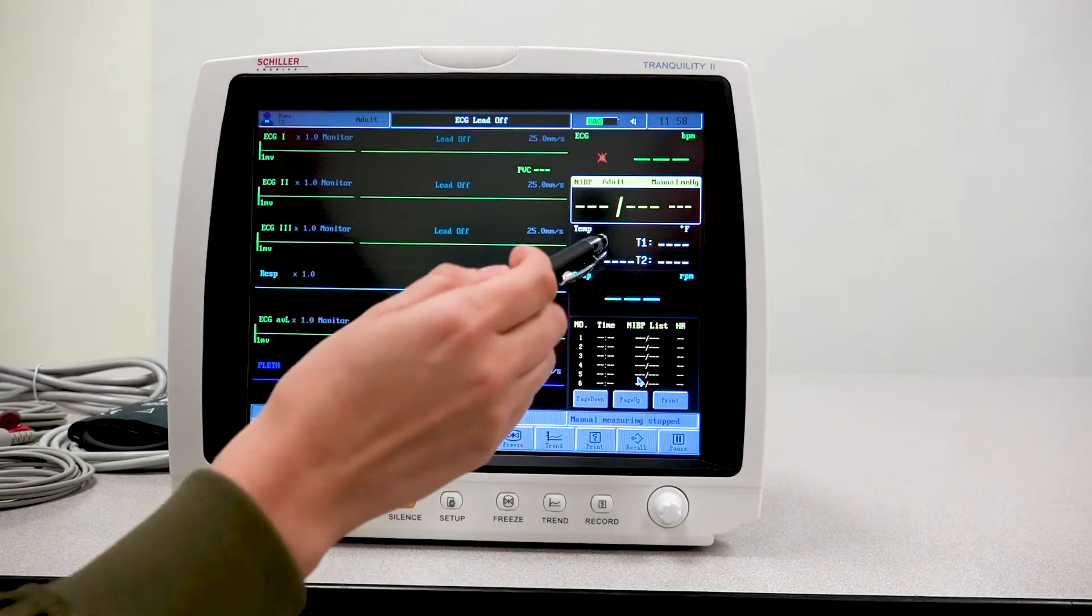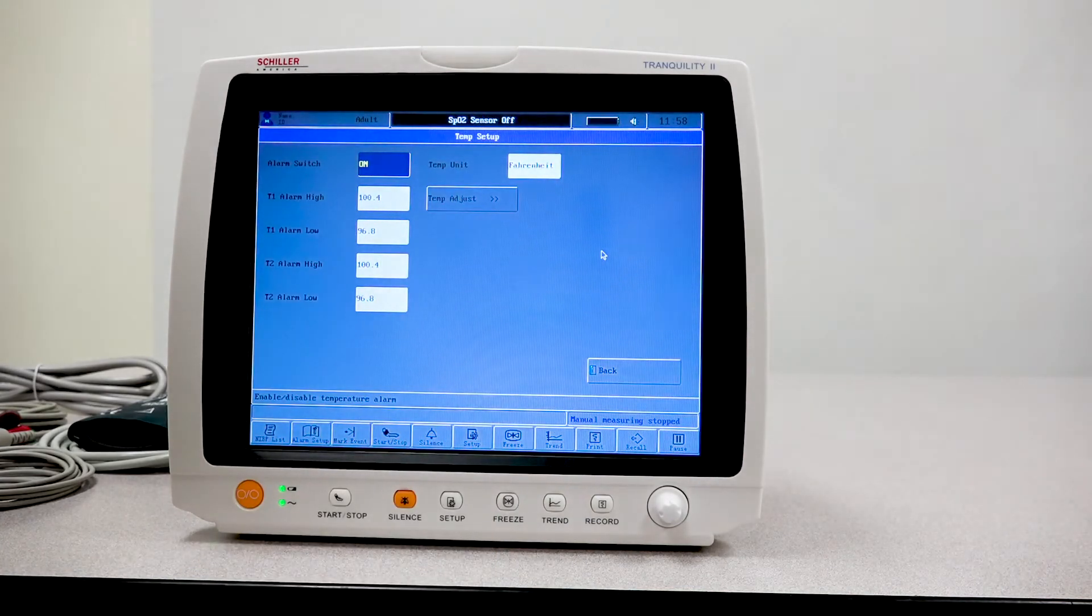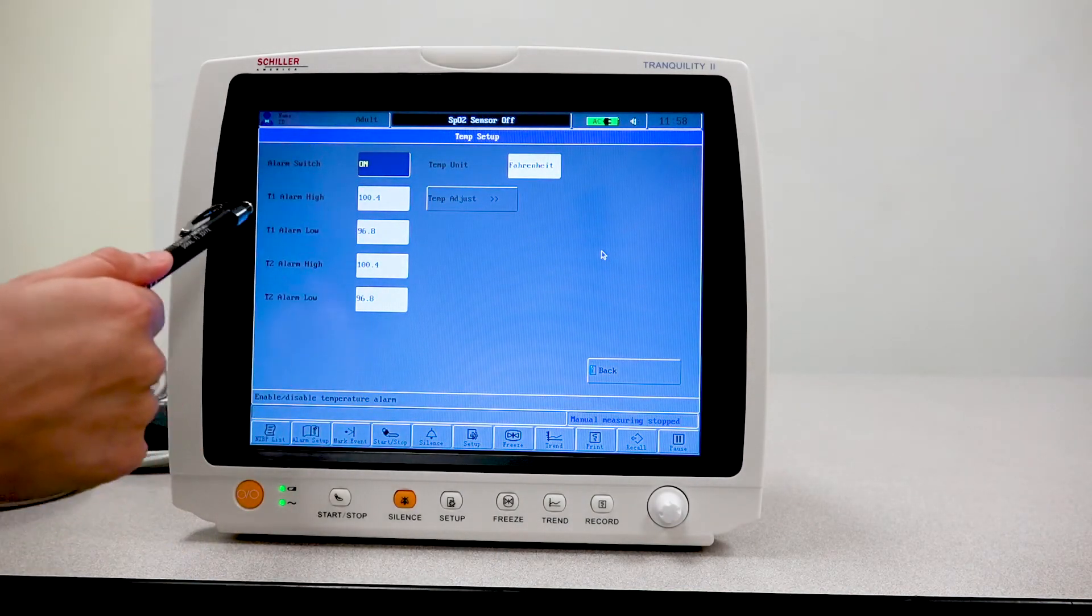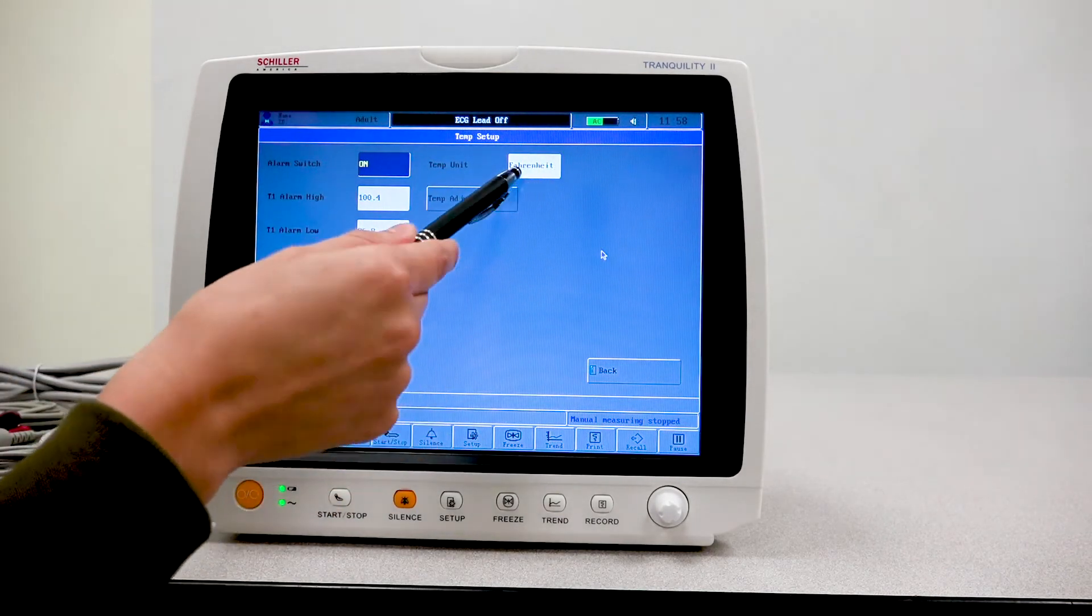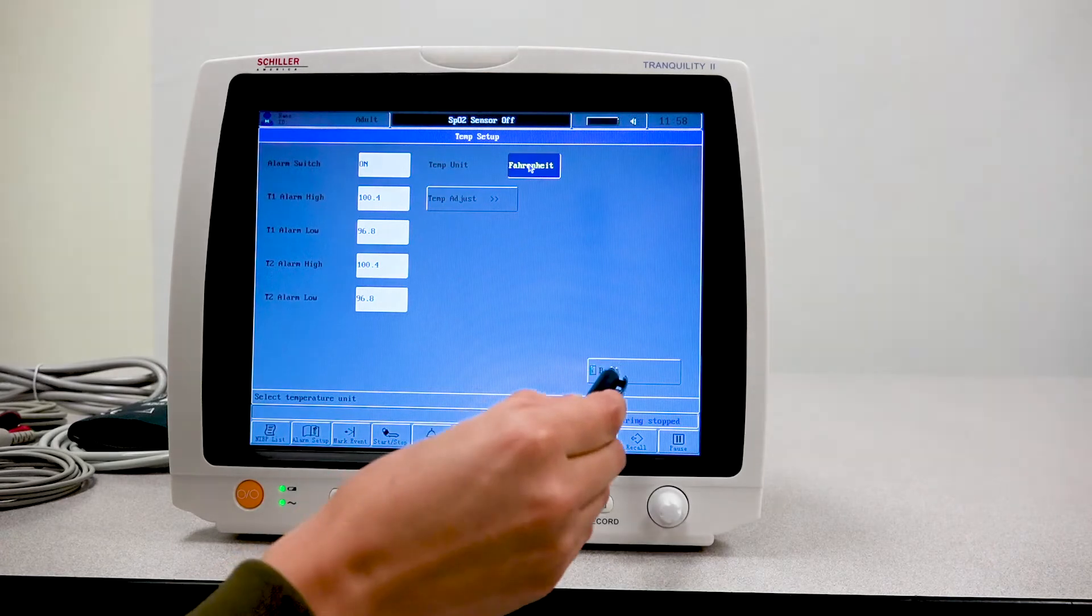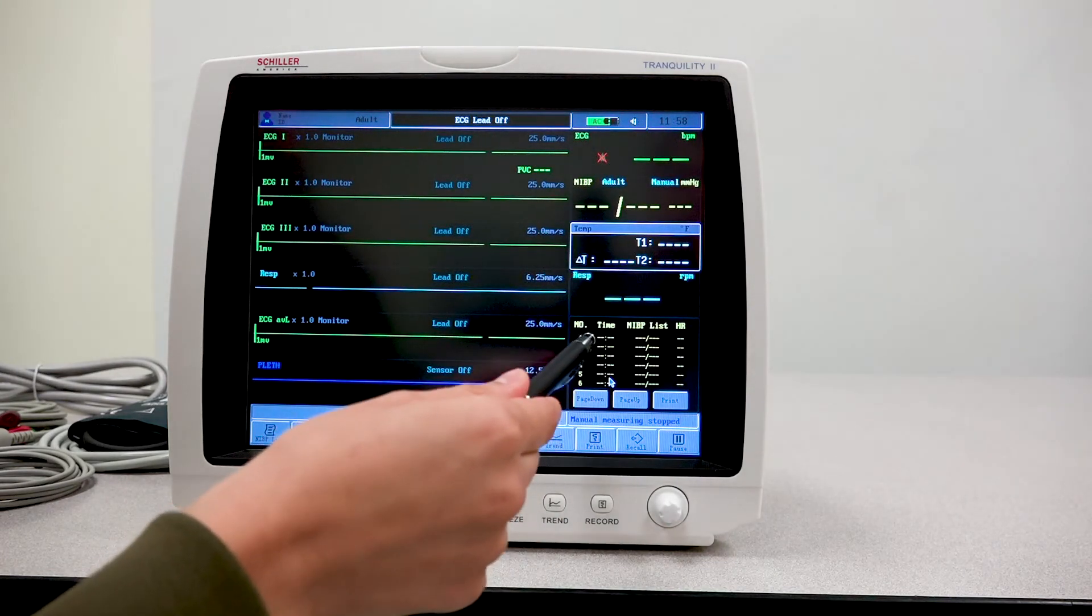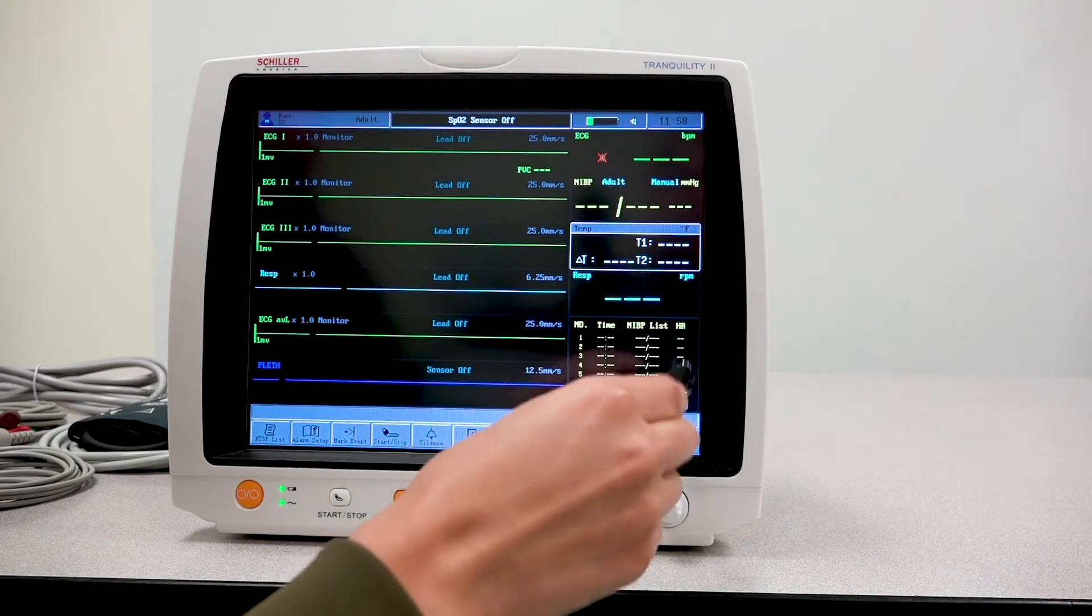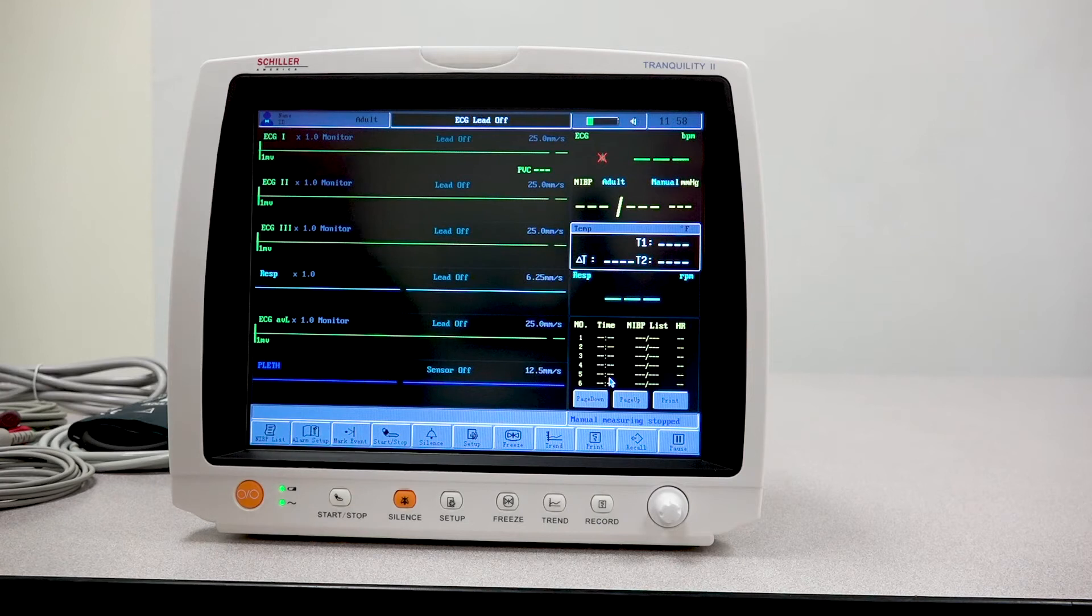If you tap on your temperature area, you're able to select the high and the low alarms and then select whether or not you want to use Fahrenheit or Celsius. In this case, let's choose Fahrenheit. And you are able to see your NIBPs that were taken here at the bottom of the screen.